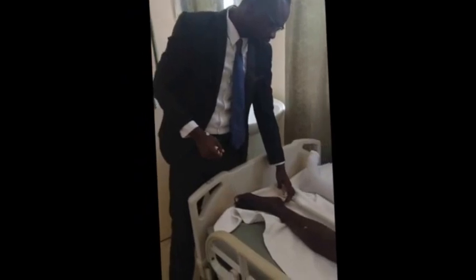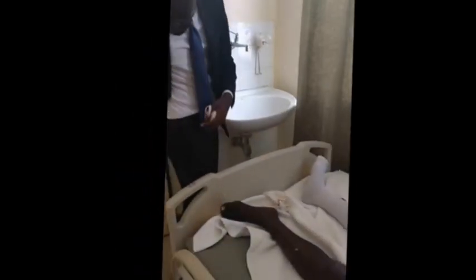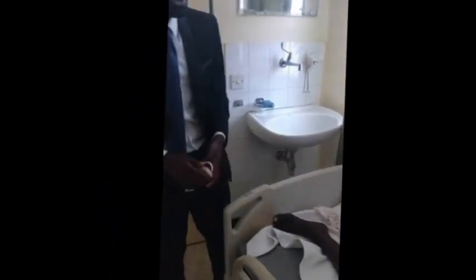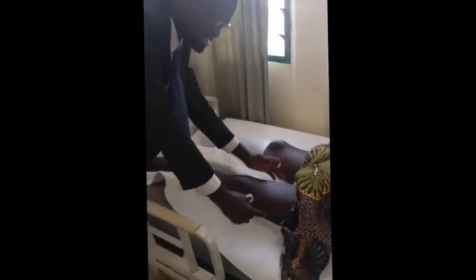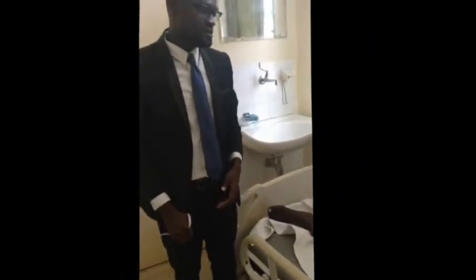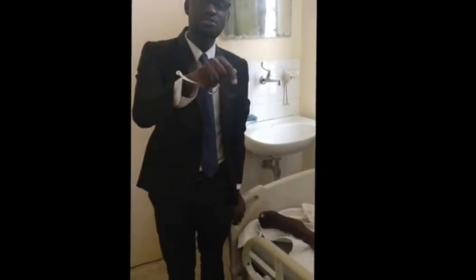But if you want to use a thigh length stocking, then you have to measure from the heel to the gluteal fold, which we can see here. The gluteal fold is around the side, just the fold beneath the gluteus maximus. And then we measure the thigh circumference, which is the widest part of the thigh. So basically these are the measurements when you want to prescribe anti-embolic stockings. Once you have these measurements, you state them on the prescription.